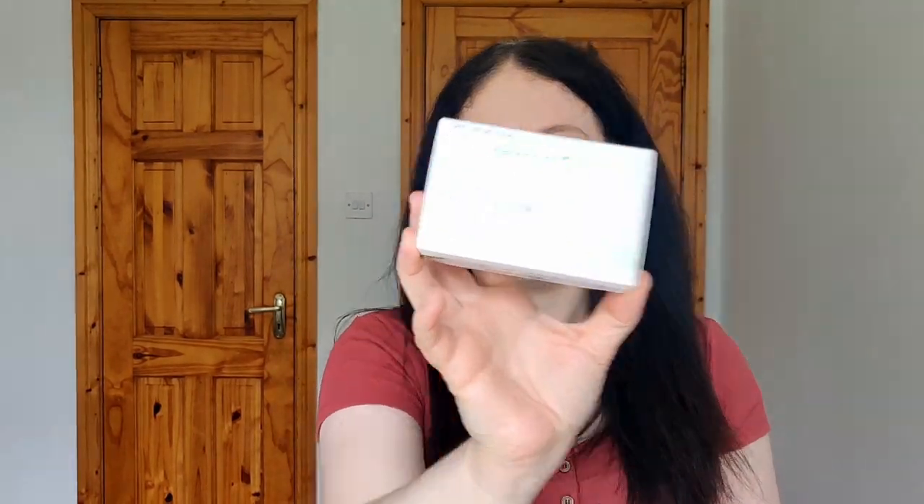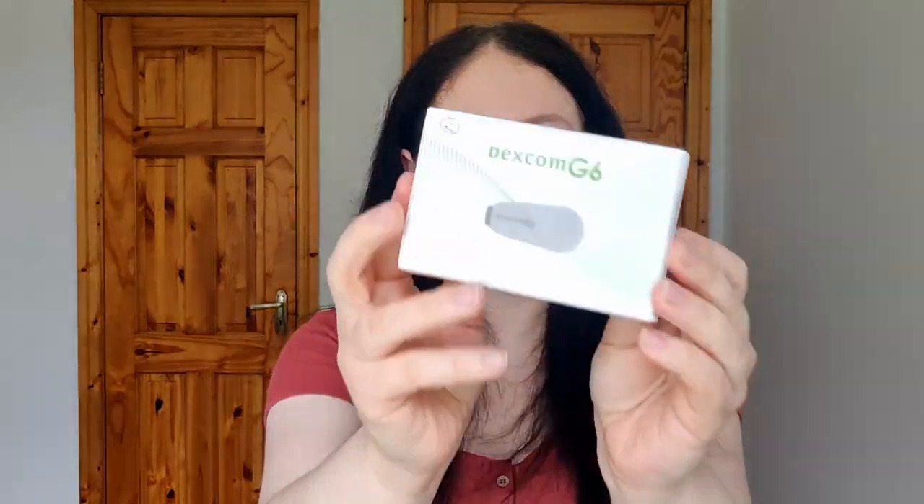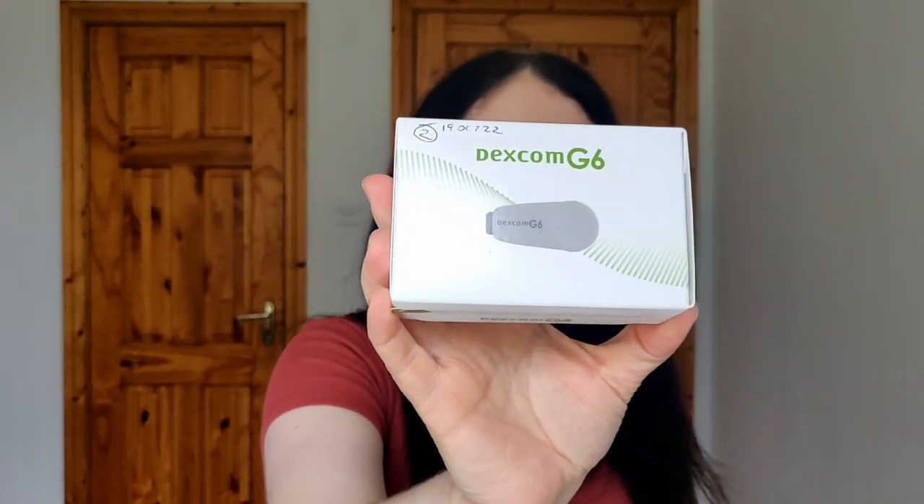I'm using the Dexcom G6. The G6 has a separate transmitter, whereas the G7 doesn't. In Ireland, every three months Dexcom themselves will send you a new transmitter. You get your sensors from the pharmacy every month, and then Dexcom sends you the transmitter directly — that's how it works in Ireland anyway.